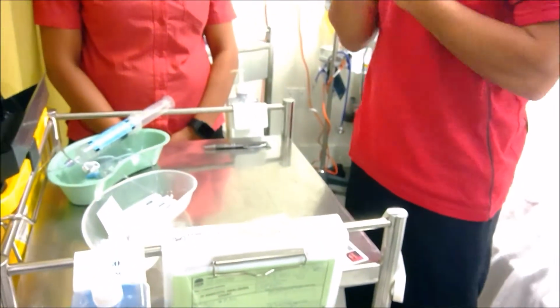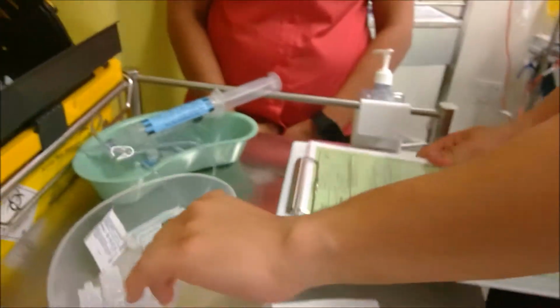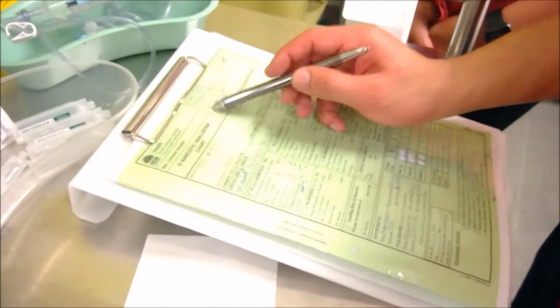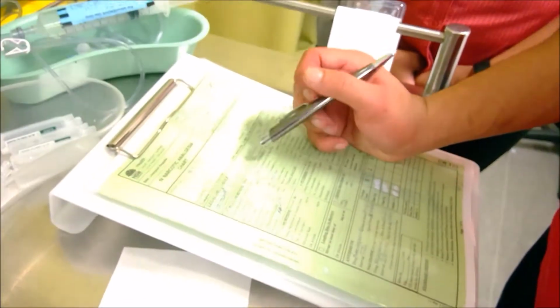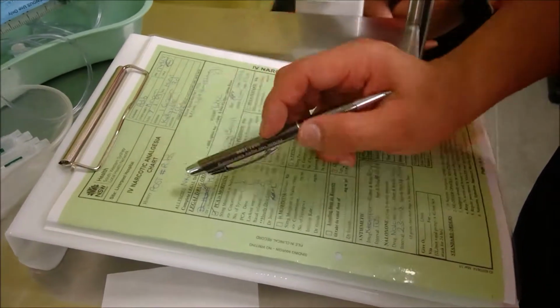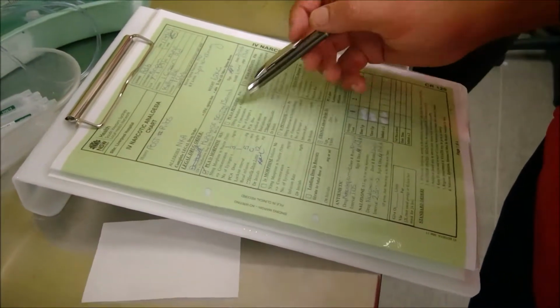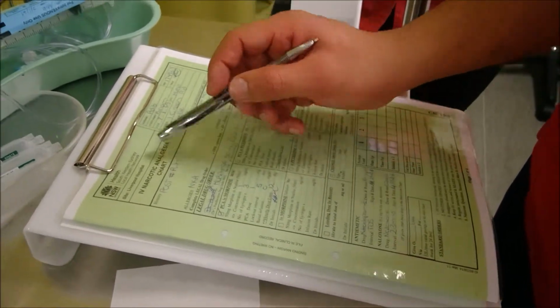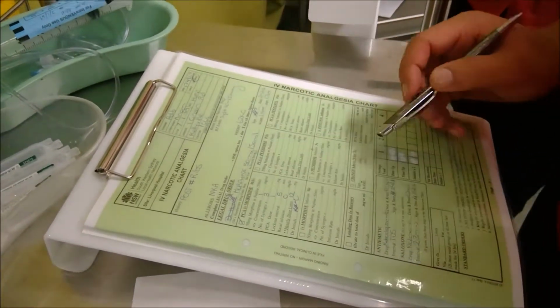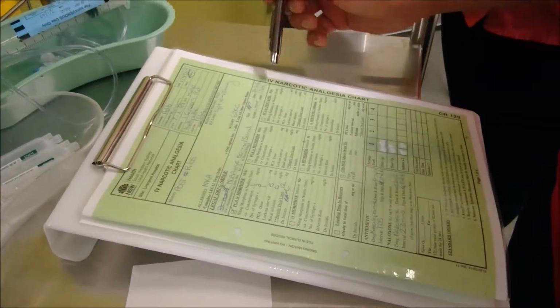Okay, going to do a second drug check. So we have Miriam Adib. Her date of birth is the 7th of the 1st, 1969. Her MRN number is 174963. She has no known allergies and she's come in for post-fractured ribs. We have a PCA narcotic analgesia chart. It's an order for morphine, 50 milligrams in 50 mils. It's been signed by the doctor. It's been dated for today, and it hasn't been given yet.